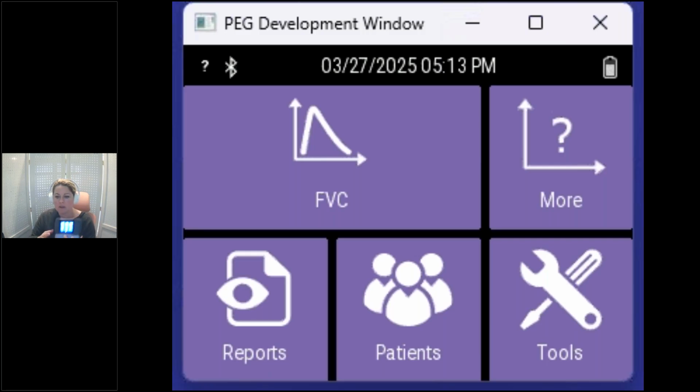All right, but one thing that this device will not do, just because of the capabilities of the port, you cannot connect via USB and then do the live testing with the EasyOne Connect software, which is a difference from the older Plus device. We do get that question a lot, so I always like to try to answer that when I can. So you can live test with Bluetooth, but not with the USB connection. All right.